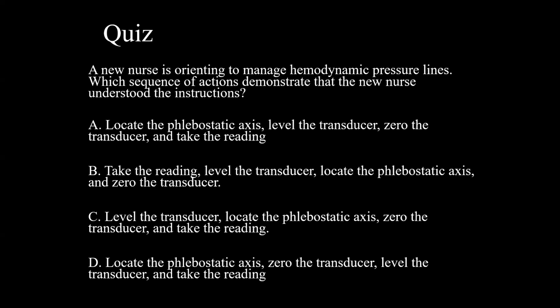So what shows accuracy in my lines? What are the two things I need to do? You have to level it and then zero it out. Right. So after I've leveled and zeroed, then I'm going to square wave test it really quickly. Okay, that makes sense. It's all kind of together to start your day off to say this is an accurate measurement of what that blood pressure should be. Okay, does that help?